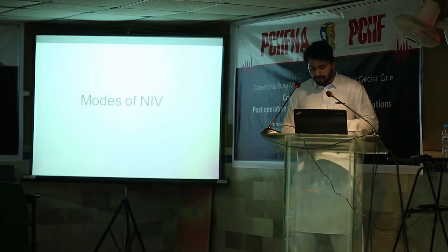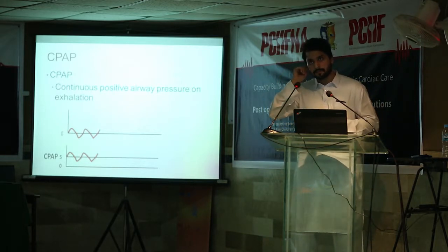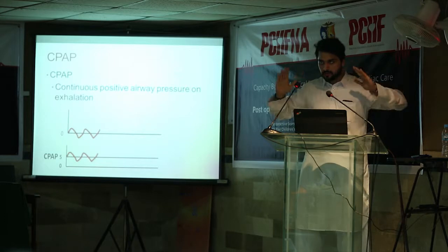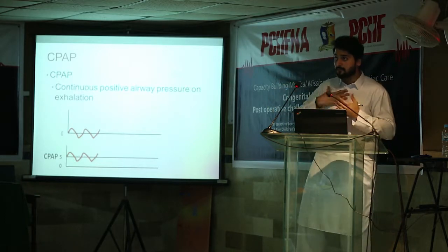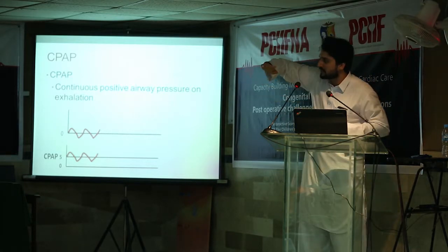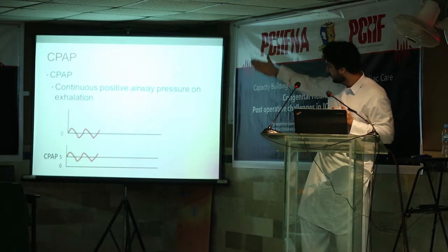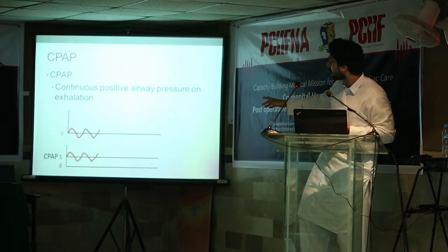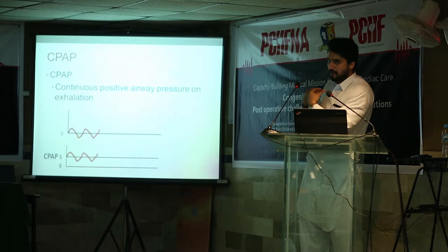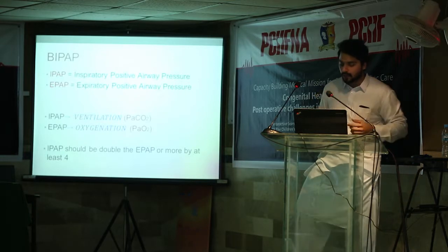Now let's come to the most important part, the modes of NIV. Everyone should know CPAP and BiPAP. What is CPAP? We always use CPAP in NIV. CPAP is continuous positive airway pressure. Simply, it is a continuous pressure in inhalation and exhalation. If I have a flow waveform from myself, the baseline is at zero, there is no pressure. Exhaling, inhaling; inhaling is negative because I have negative pressure. When I apply CPAP, the baseline is no longer zero. I applied some pressure, so it's 5. That's CPAP. It will improve my FRC, recruit my lungs, and help with oxygenation.